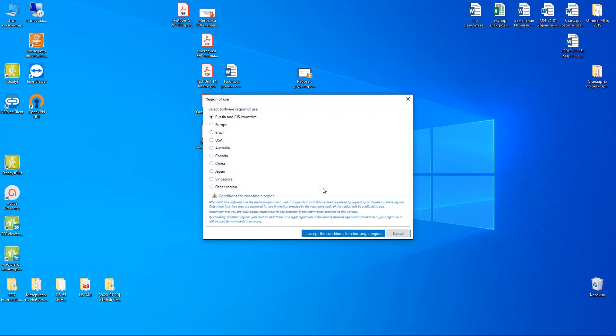Only on the first start of the software, you need to choose the region where you are located.